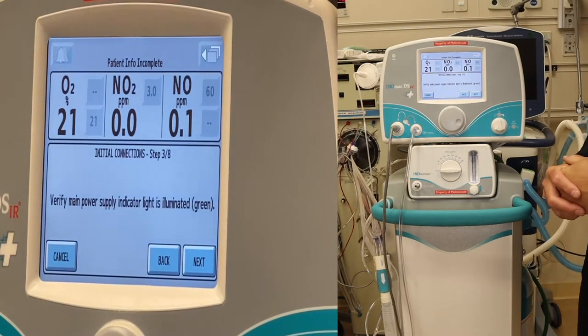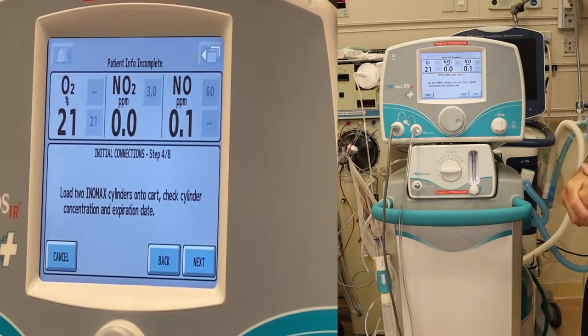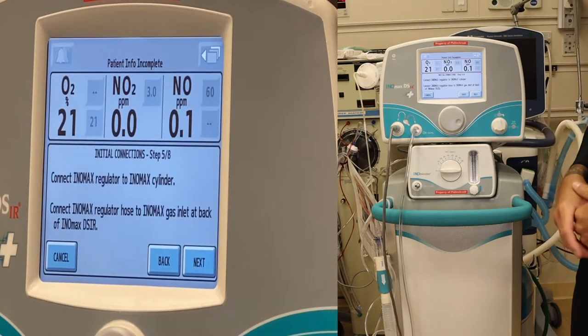Verify the main power supply indicator light is illuminated and is green. Press next. Load two INO MAX cylinders onto the cart. Check cylinder concentration and expiration date. We have two brand new cylinders in the back. Press next.